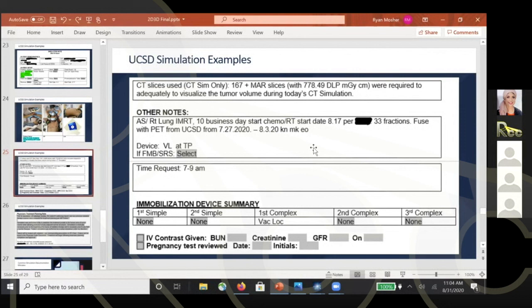More imaging. So we can fuse the MRI, PET CT, whatever we have, in order just to make an idea from collectively all the imaging together. That's correct. It takes all of the imaging and puts it into one image. Okay. And do you put the patient during simulation in the same position as the MRI or CT, or is there a universal agreement regarding the positioning itself in order to make the fusion easy?